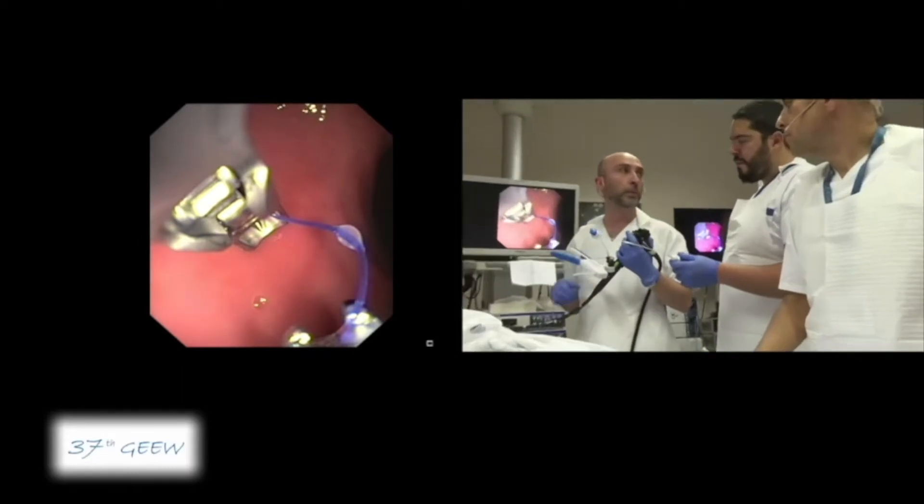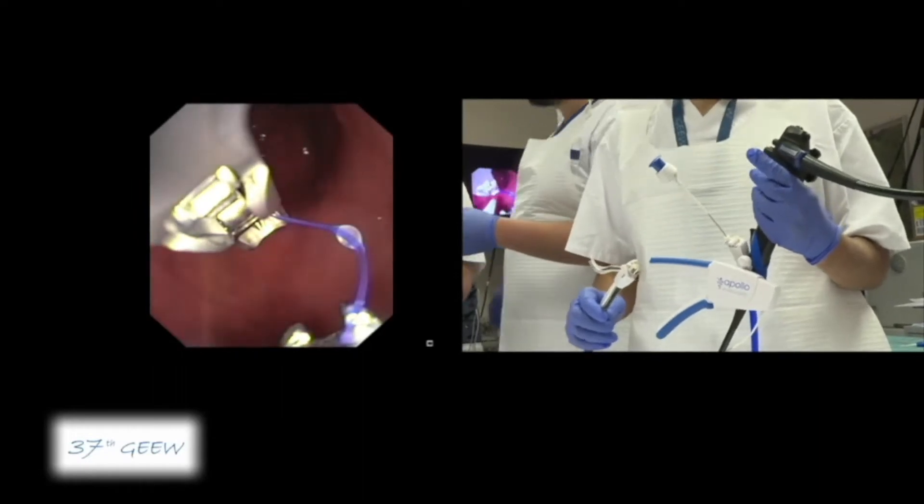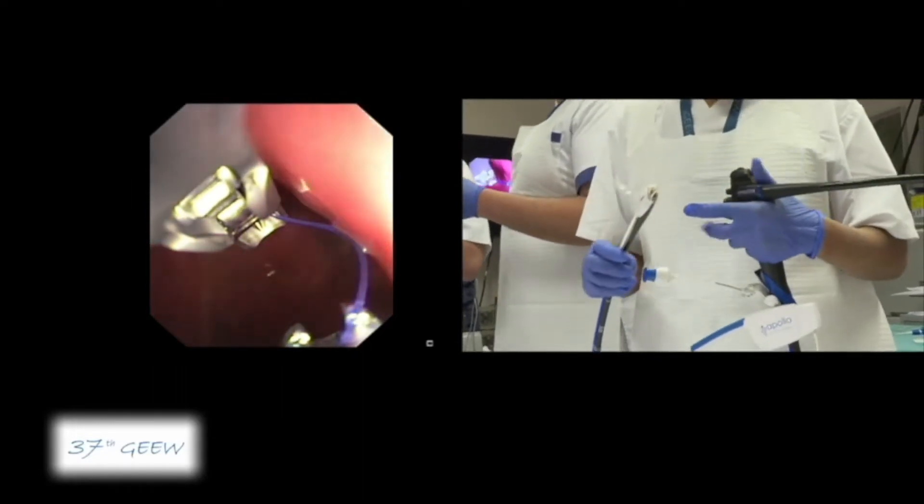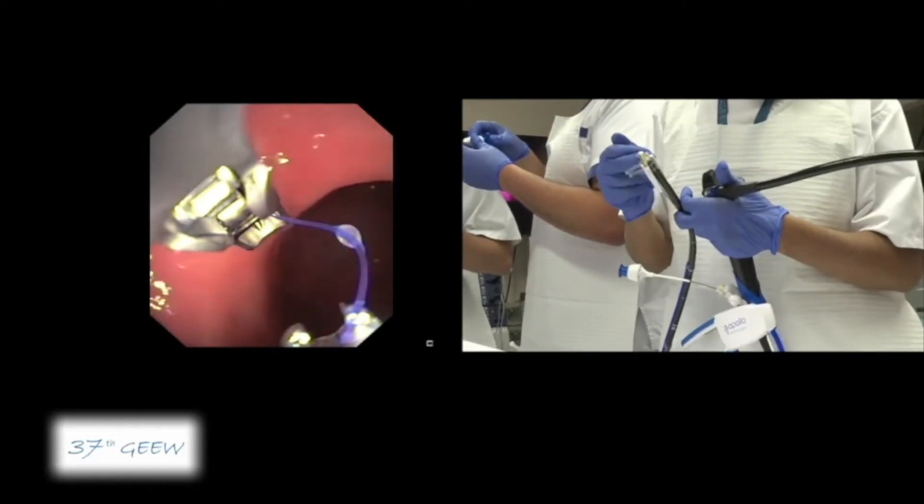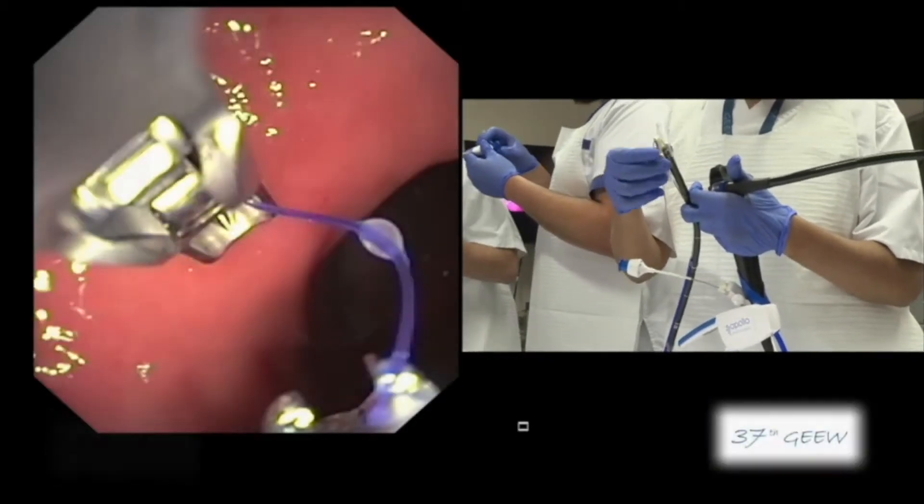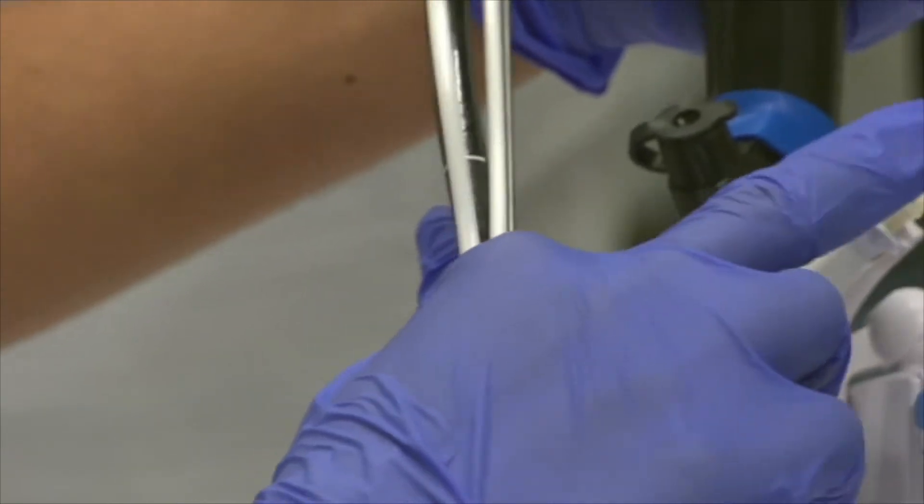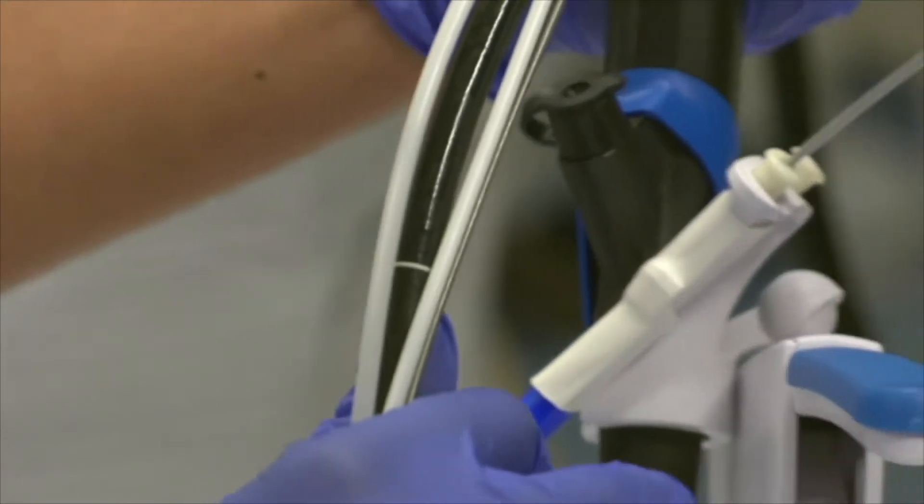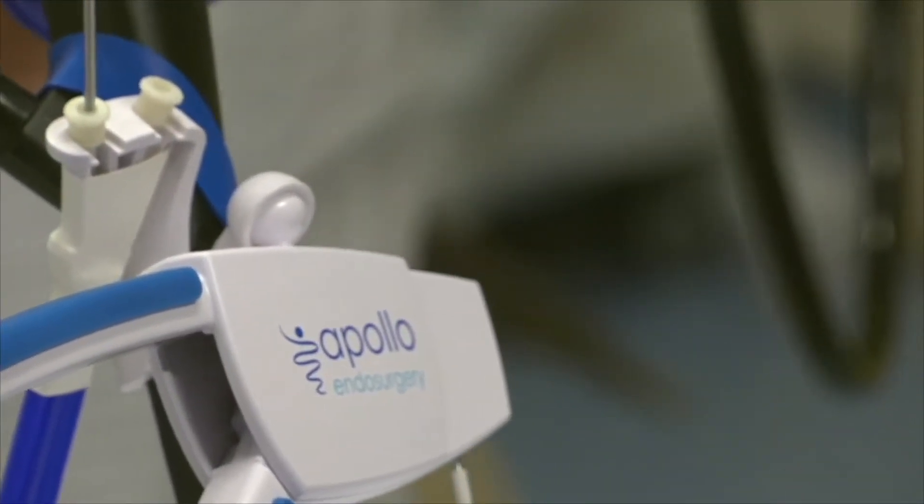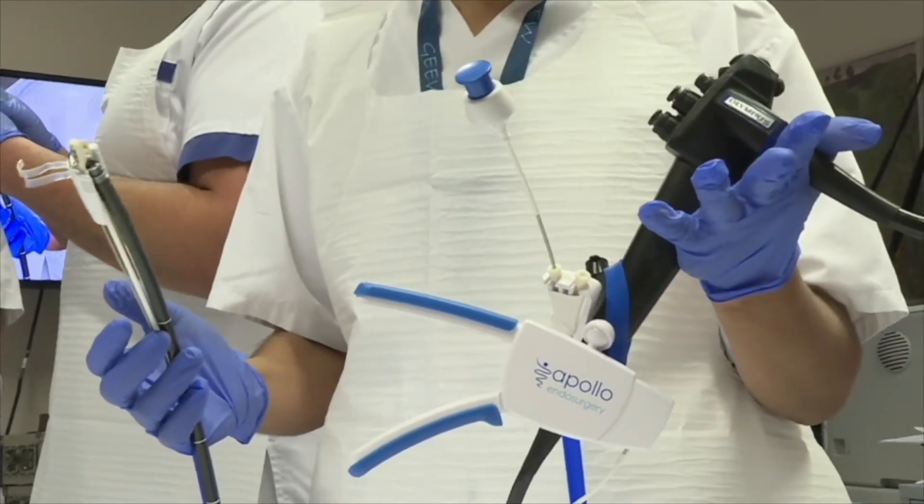Helix and Youssef will help me with the Helix. The first version which Ivo will use is only compatible with the double channel Olympus scope. But this new version is compatible with any normal gastroscope. You can see here the first tip has these two elastic bands you put on externally on any gastroscope, and you have these two working channels that go up to the handle where you can use one for the grasping tool. The good news here is that we can now use the Apollo with any device, with any scope.